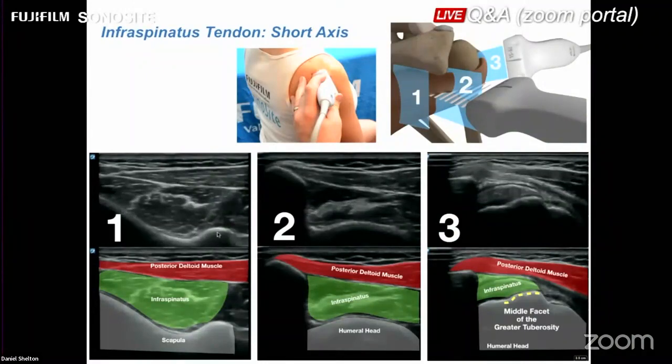This is the inferior glenoid, and we'll talk about that when we get to the teres minor, but it is a great landmark for you to look at the muscle belly. As we travel distally towards the humeral head, you will start to see a more dense central tendon and perhaps some cartilage here, and then you're going to get a lot of shadow from the acromion, and we're going to do some maneuvers in the live scan to get rid of those.